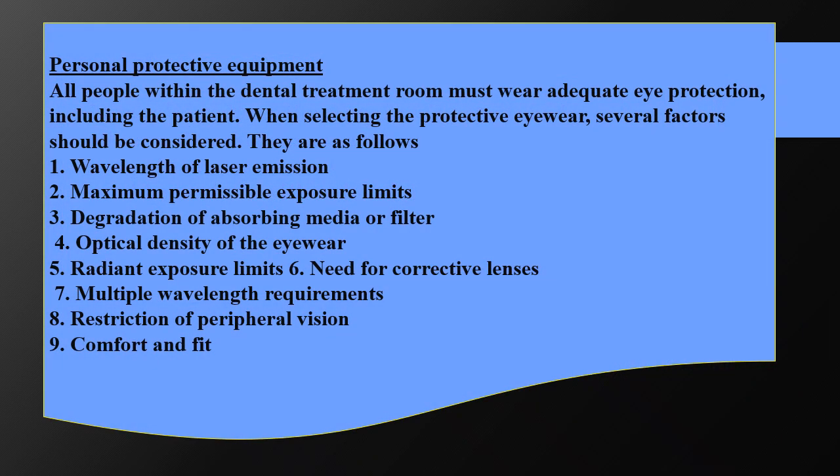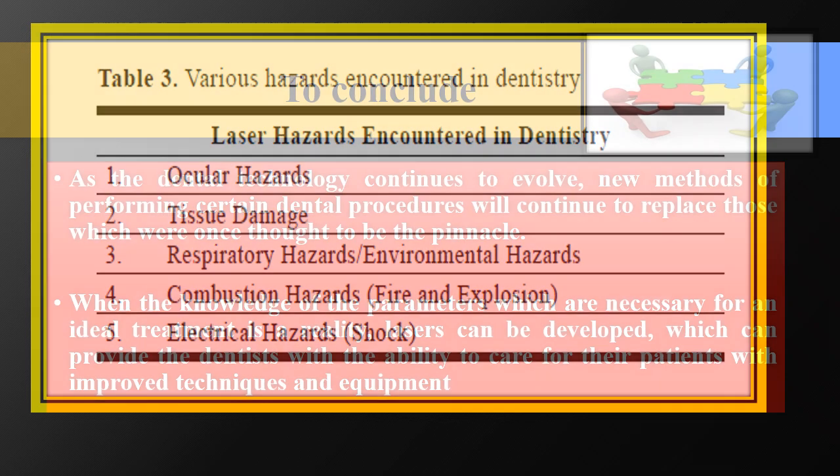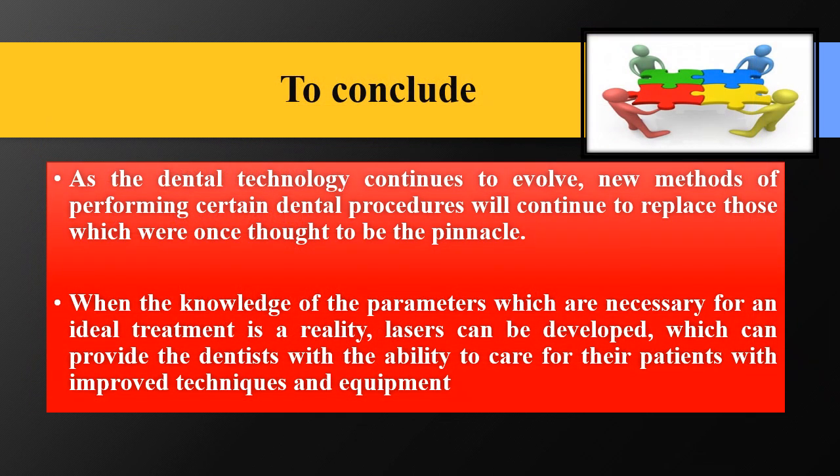When we use laser, there should be protective equipment that a dentist should use. The wavelength of laser emission should be properly managed, and the maximum permissible exposure limit should not be exceeded. Other considerations include degradation of the absorbing media or filter, optical density, multiple wavelength requirements, restriction of peripheral vision, and comfort and fit. Various hazards encountered in dentistry are ocular hazard, tissue hazard, respiratory hazard, combustion, fire and explosion, and electrical shock.